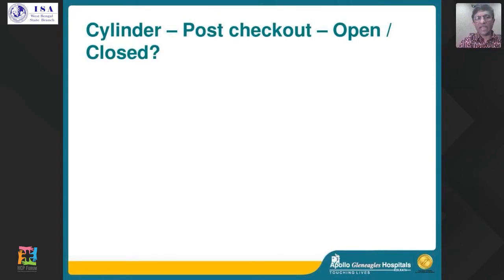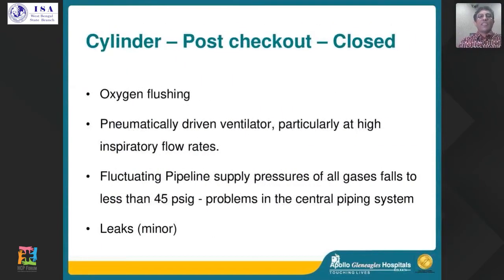You do the machine check. You open the cylinder 2.5 turns, you see the pressure, and after you do it, should you keep the cylinder open or should you close it? This is why I would have loved to have an interactive audience who would have answered this. Anyway, the answer is you keep it closed.